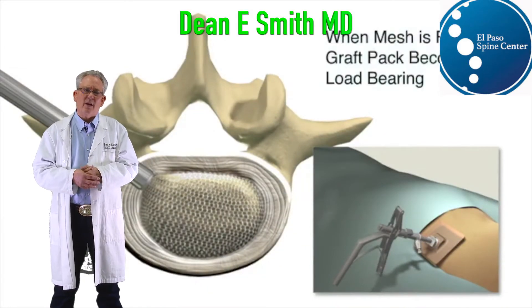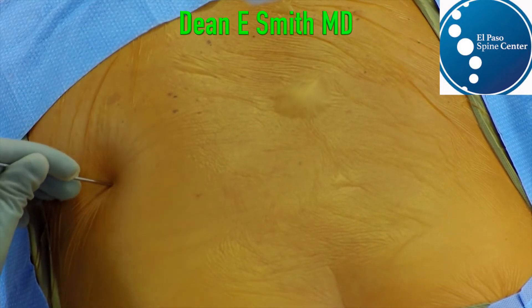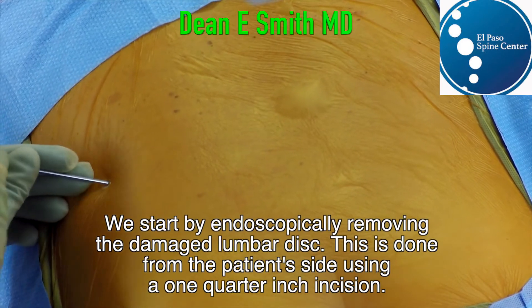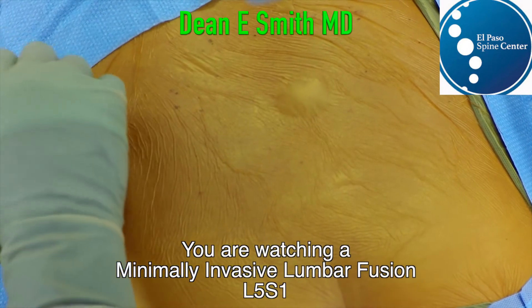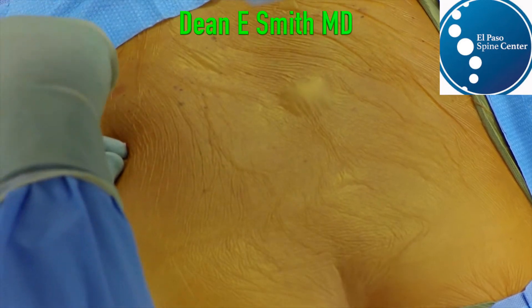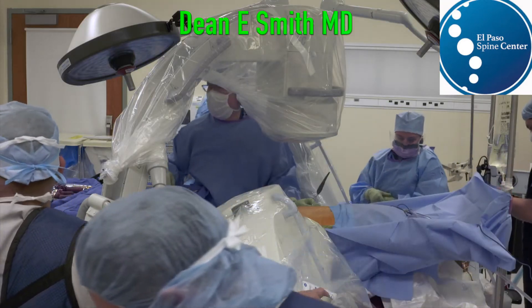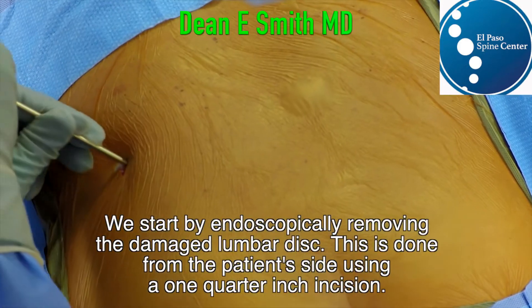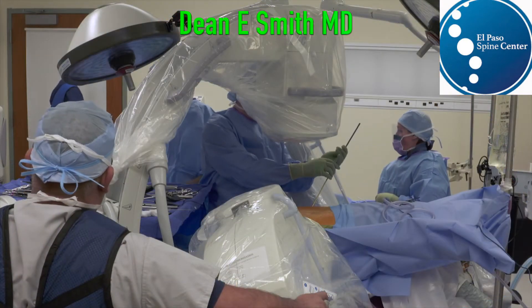This is an example of a patient undergoing a percutaneous L5-S1 fusion for a PARS defect or spondylolisthesis. Initially, we begin by placing a pin in the disc space. We use a combination of spinal cord monitoring, fluoroscopic guidance, and direct visualization. Over the pin, we place various dilators until we get large enough to finally place the working cannula.